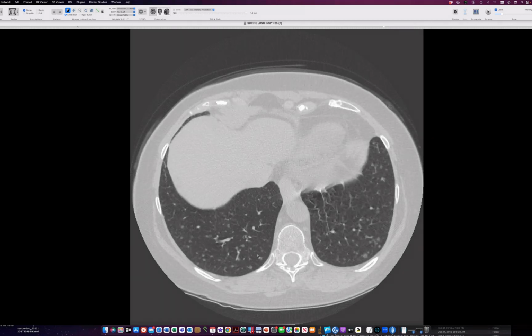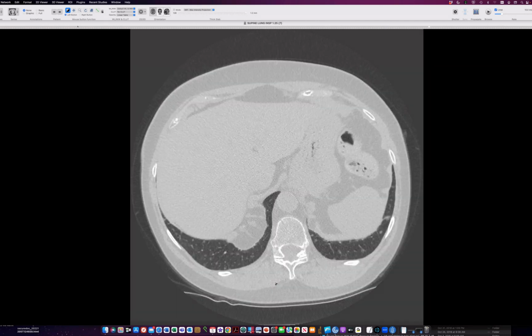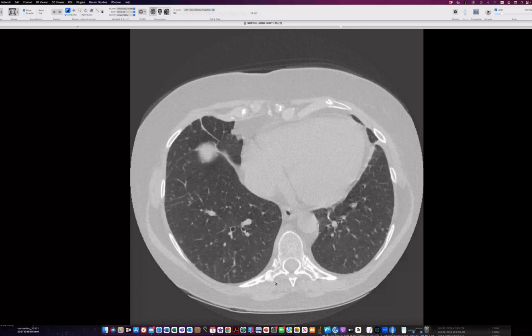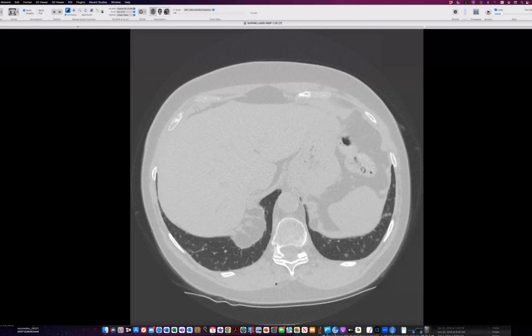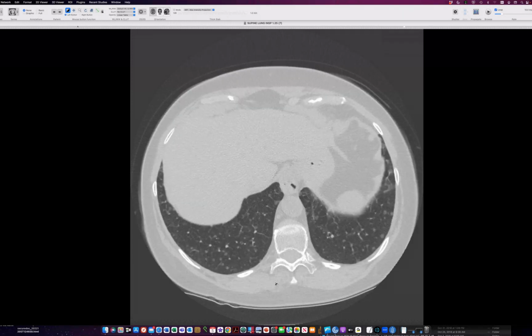So Sudhakar happened to be in the room yesterday when this case came up, and he said there are very few causes of Cheerios. You think of Langerhans cell histiocytosis, some adenocarcinomas. I don't know whether he said pneumocyte hyperplasia or not, which came up earlier in the conference today, but he says the big thing is the meningothelial-like nodules. And so he thinks that that's what this is.